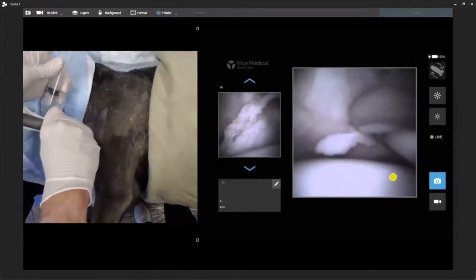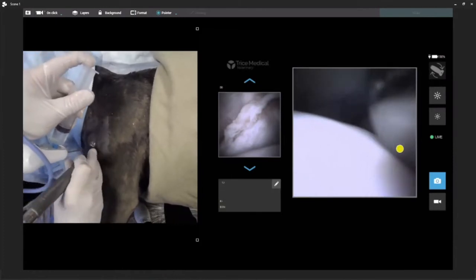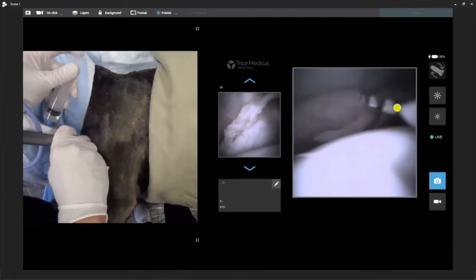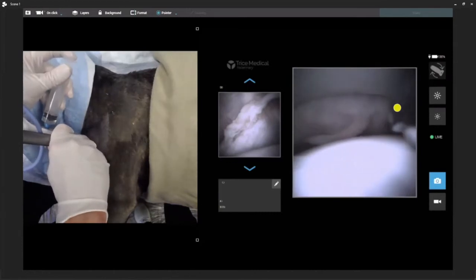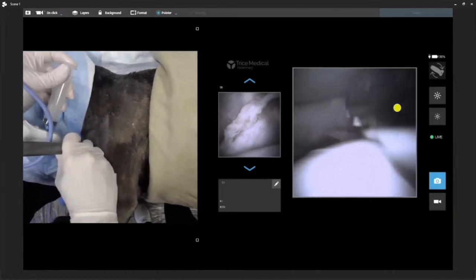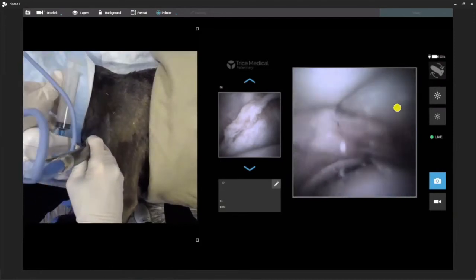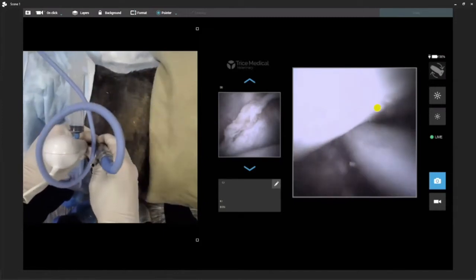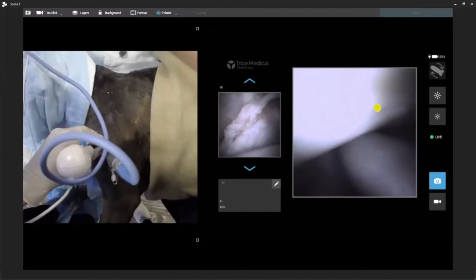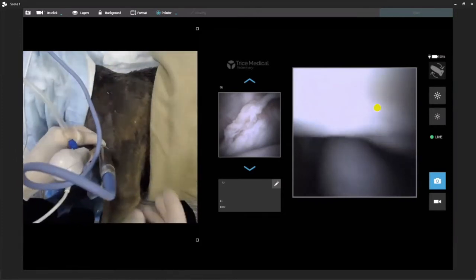And then we can do any kind of treatment. If we want to treat an OCD, we can come here caudally — there's my switching stick — and there's my shaver. So if we want to shave for a shoulder OCD, you can see very easily we can do that. We can retrieve our flap and shave. Now let's connect the fluid pump. Now I have my fluid pump on. If you're going to do a treatment, instead of switching syringes over and over, it's much easier to just go ahead and use a fluid pump.